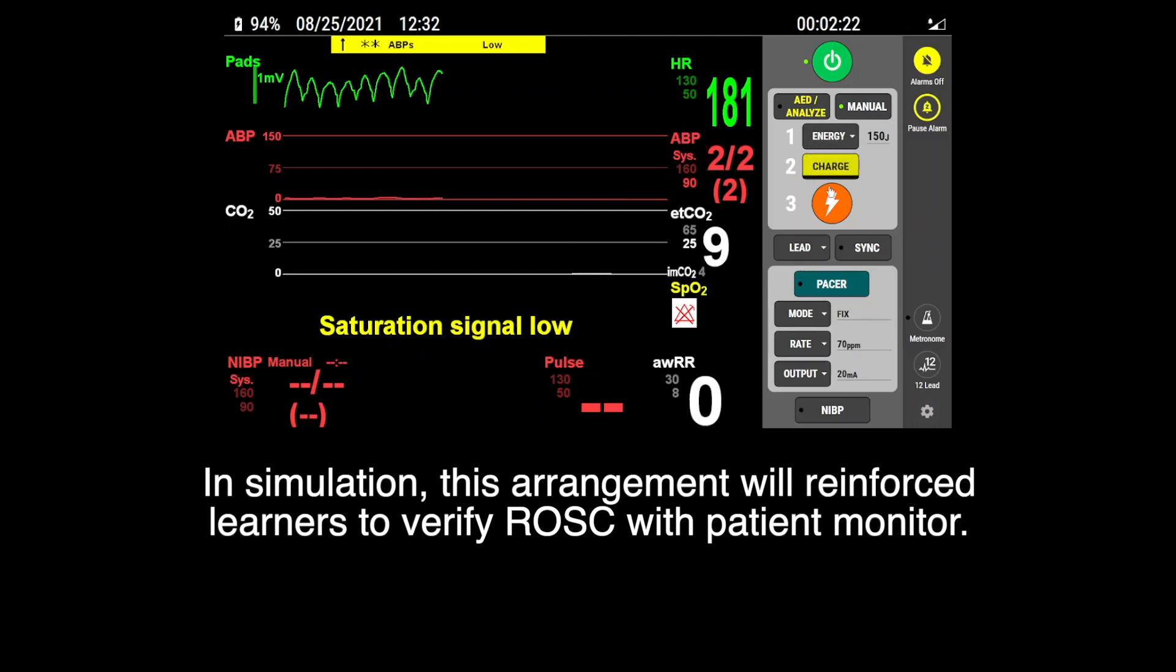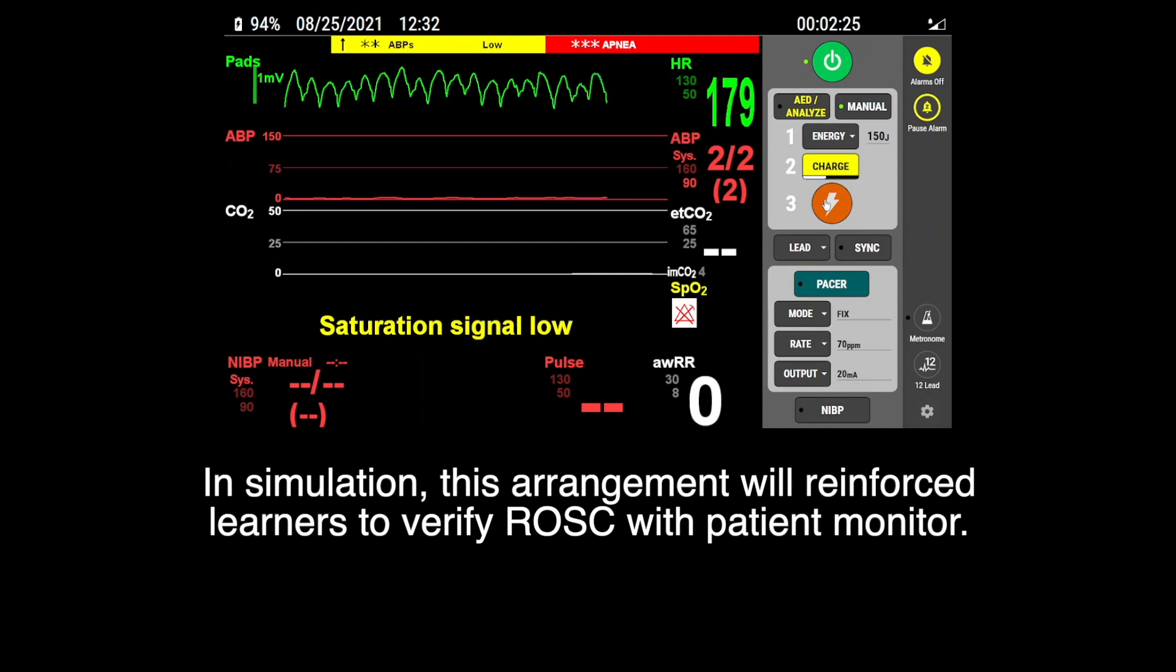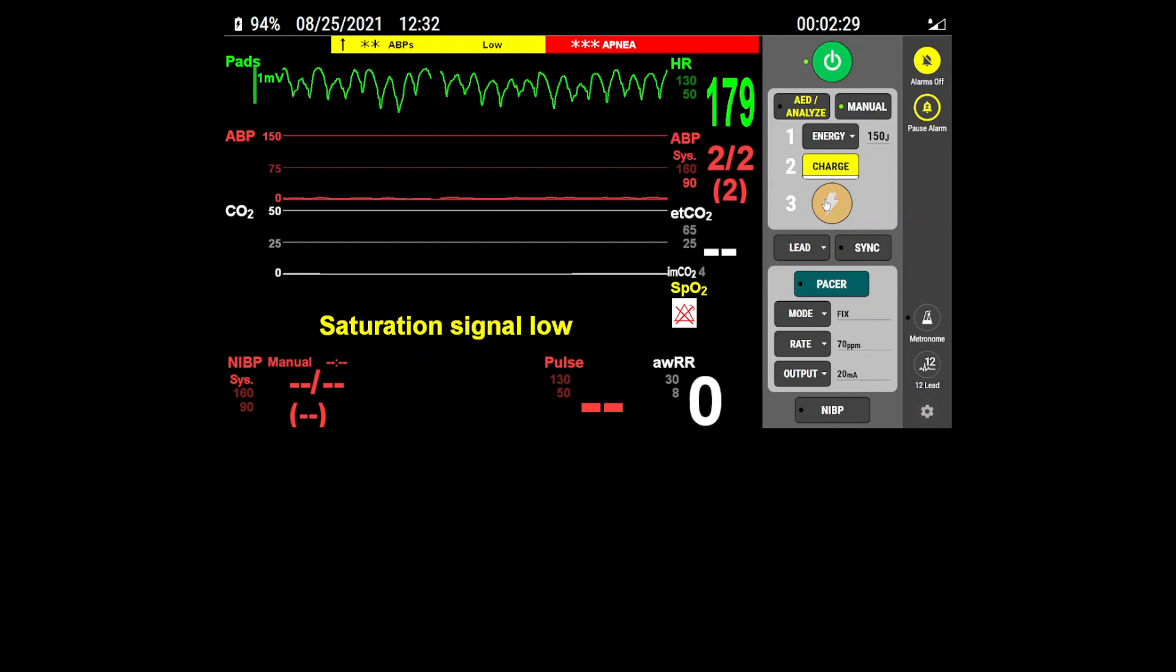In simulations, this arrangement will reinforce learners to verify ROSC with patient monitor.